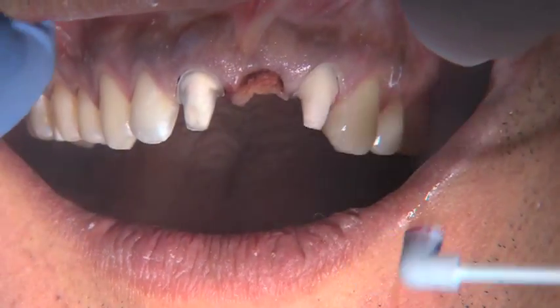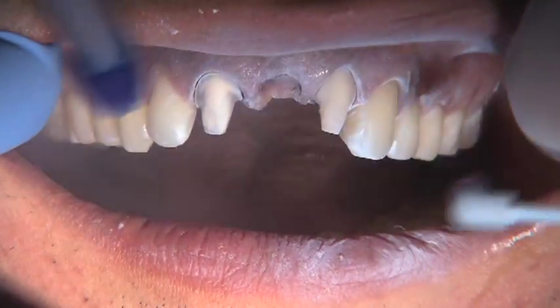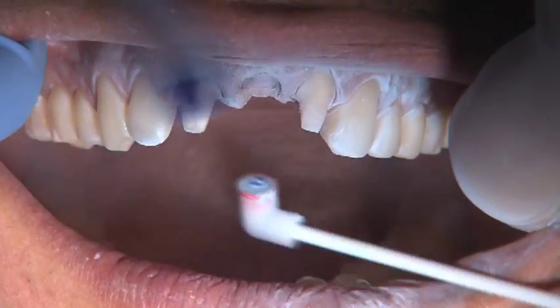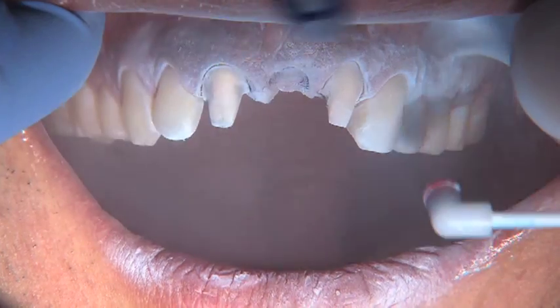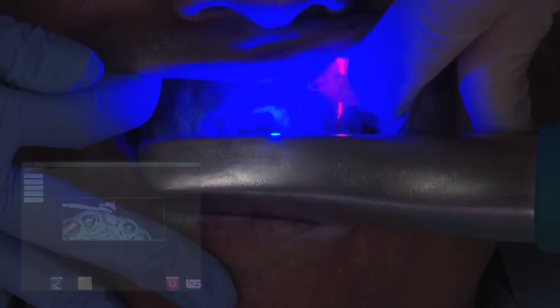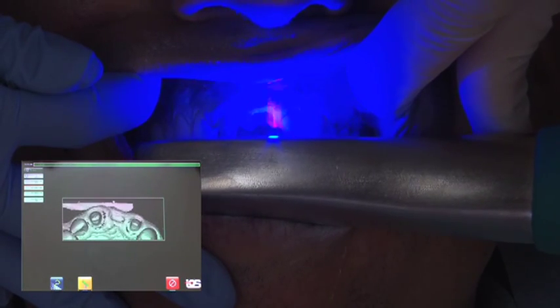Typically my assistant would take out the top retraction cord and we'd go ahead and start putting some polyvinyl impression material in place, but I'm not doing that. I'm using the iOS powder to go in and powder the two teeth that we've prepped. I'm powdering the ovate ponic receptor site and making sure that I get some powder on the adjacent teeth as well.